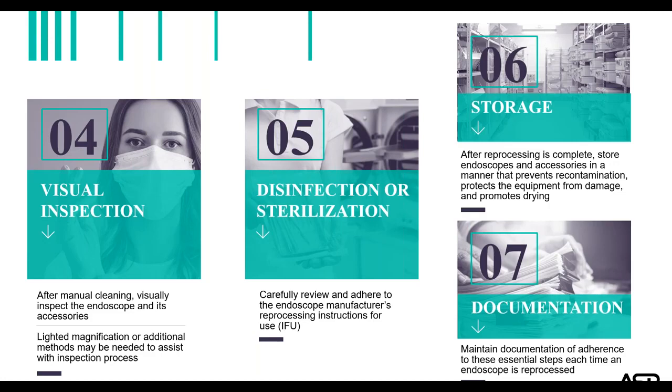Documentation is essential for quality assurance and patient tracing. So HICPAC has an audit tool on the CDC website that outlines what should be included in this. And this is available to anybody who goes to the CDC website.